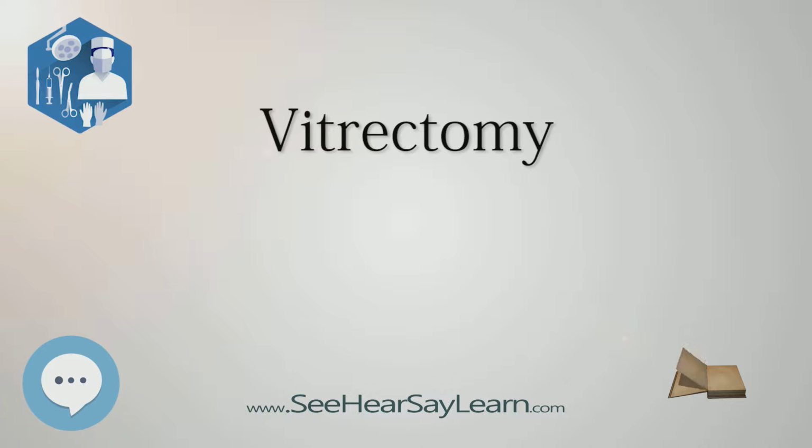Pars plana vitrectomy is a general term for a group of operations accomplished in the deeper part of the eye, all of which involve removing some or all of the vitreous humor, the eye's clear internal jelly.